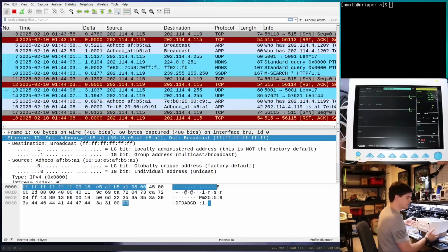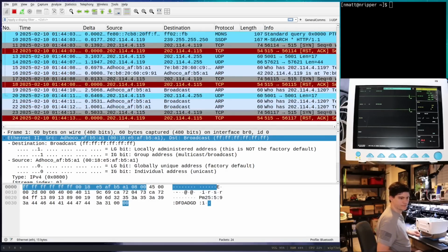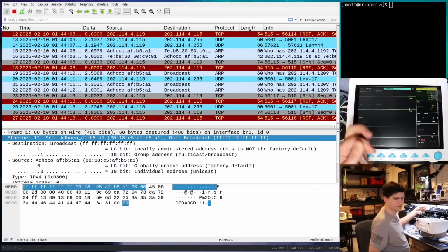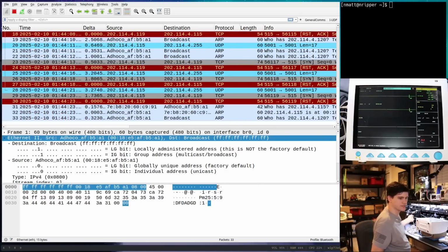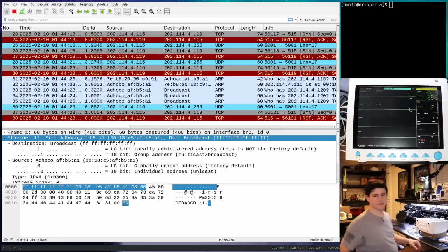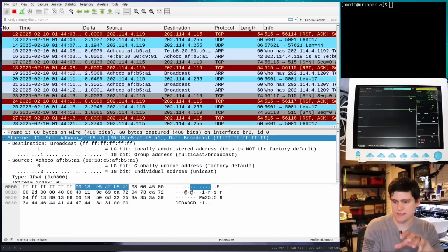And there you can see a couple of things on the screen. Down here is the hardest thing to read, but there's T1. There's a temperature sensor, so I have this skin temperature sensor here that I can hold in my hand. I can see this number go up, and later we're going to mess with the pulse ox stuff up here. But first, I want to look at the network packets and see what's going on.